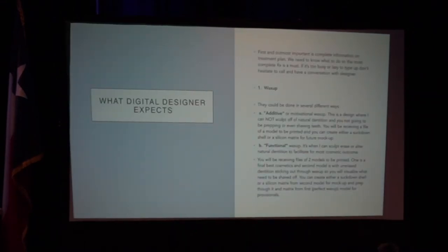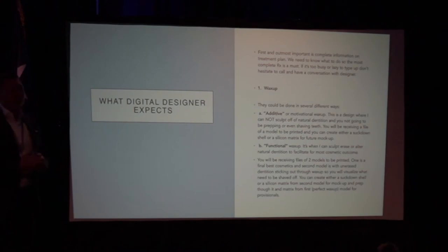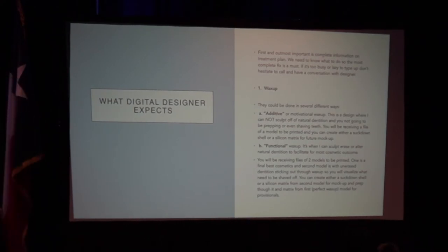So does anybody know what an additive wax-up is versus a functional wax-up? I kind of want to talk about this because I was very, very confused about it, but this is what a digital process allows you to do. The cases, we can plan them a lot better. And I'm adding some things because some of these were unclear to me when I first started out too.